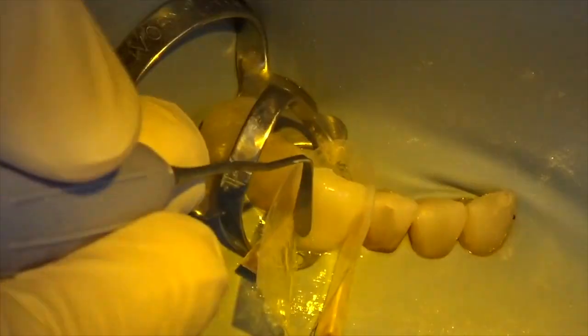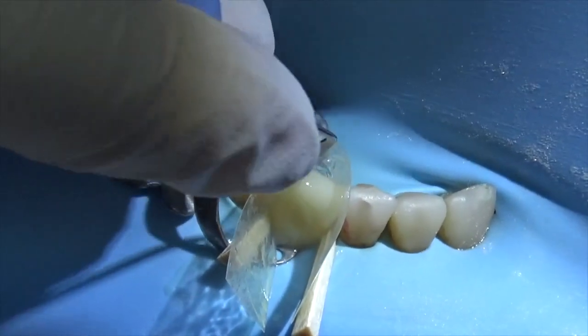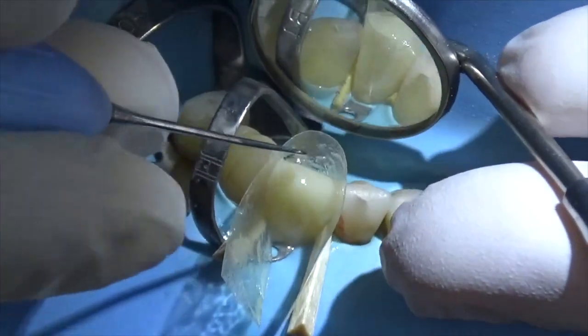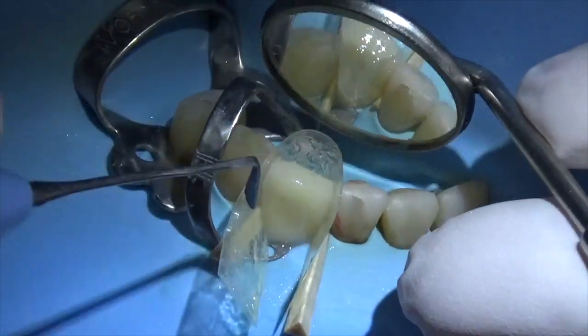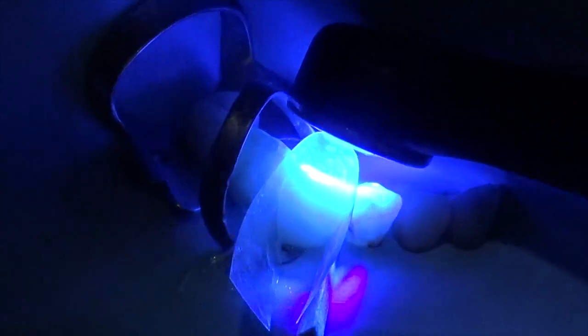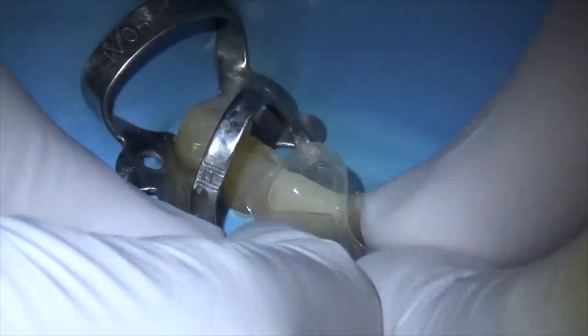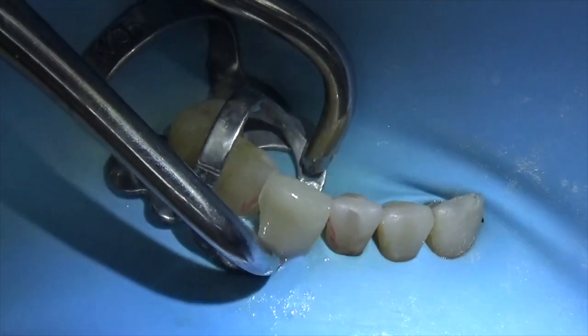In the past I haven't used airabrasion, so quite likely the tooth had plaque on the remaining tooth structure. Nothing fancy here — I'm not trying to get the shape too right. I'm just fixing the excess on the back of the tooth, because the back is hard to trim if there's a lot of excess, and getting the height roughly correct. Everything else I'll fix with the cure.